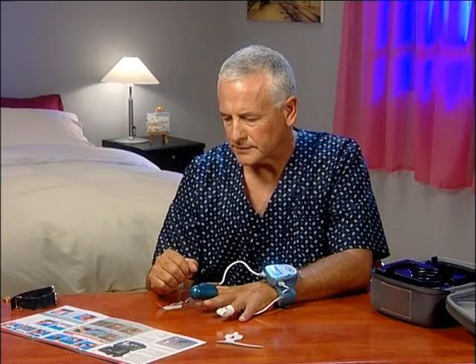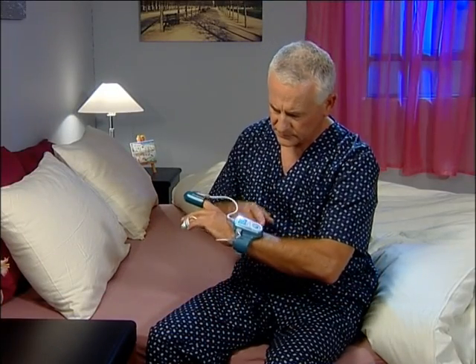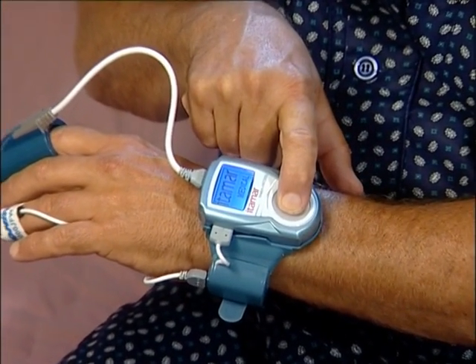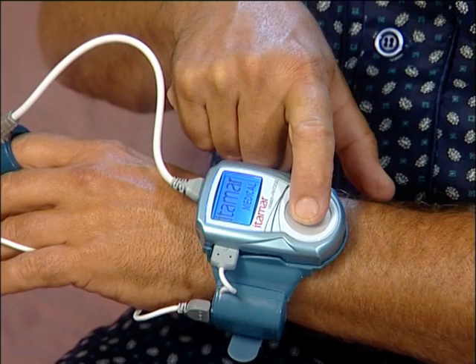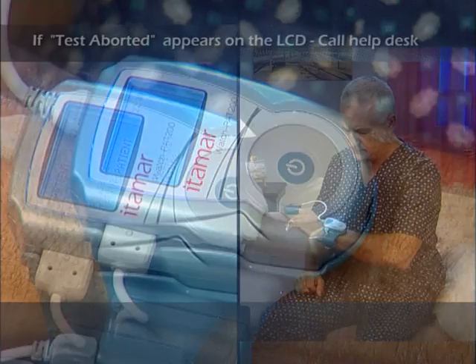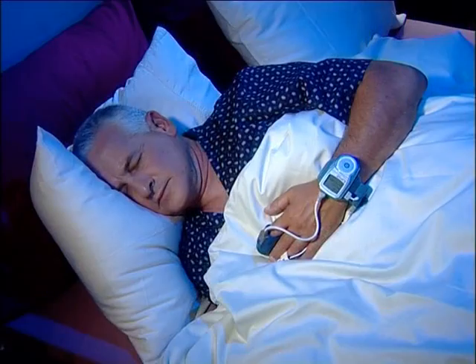Now you are ready to turn on the WatchPat. Get into bed and press firmly on the round button for a few seconds. Keep pressing until you see 'Itamar Medical' on the LCD screen. After 30 seconds, 'Good Night' in the middle of the screen indicates that the study has started. If there is a problem, you will see 'Test aborted' — note the error code and call the help desk. The WatchPat is now working properly and it's time to go to sleep.